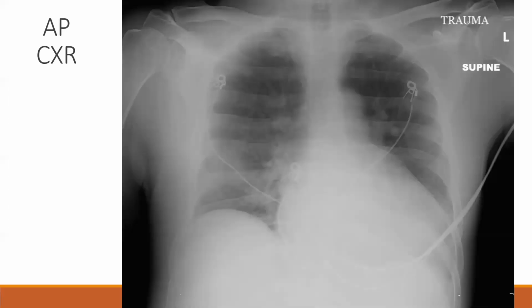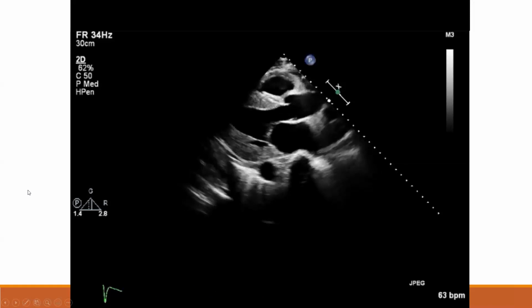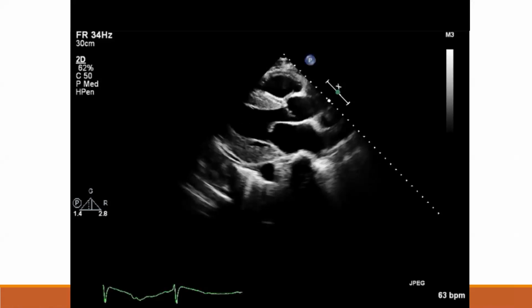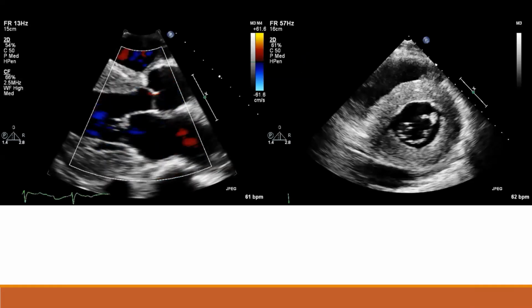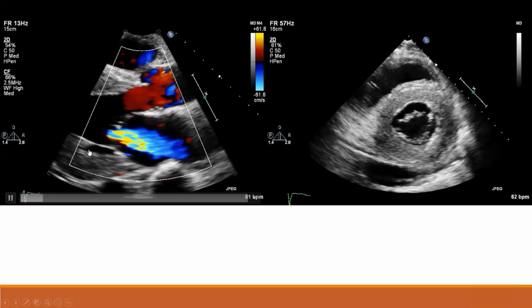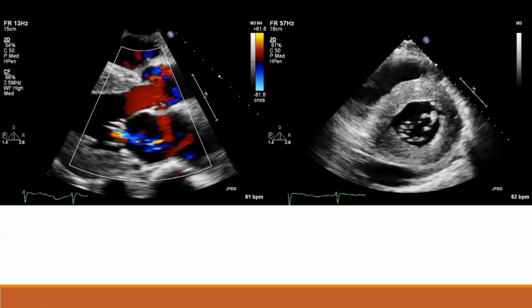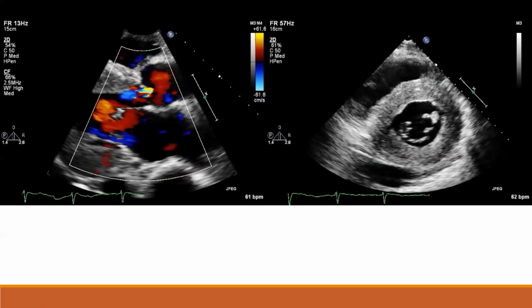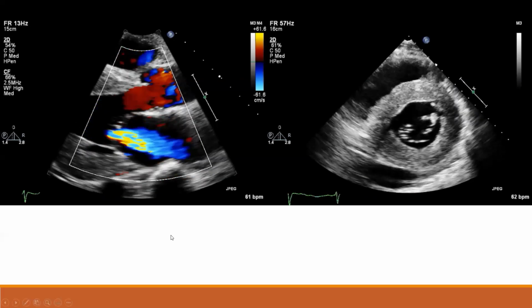Here's his chest X-ray, which shows some pulmonary vascular congestion. And then here's his echocardiogram. So certainly his echocardiogram's abnormal, and what we see is that there's thickening of both the interventricular septum as well as the lateral wall. And in our short axis view, we can see there's pretty much diffuse thickening. Also a good bit of mitral regurgitation.